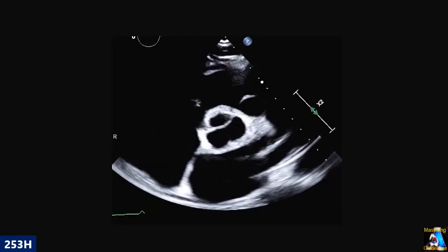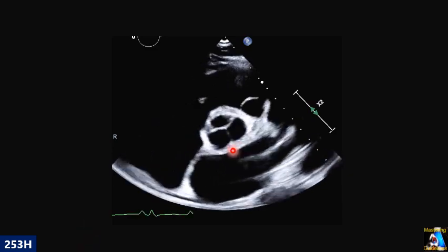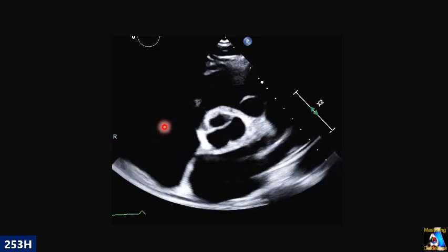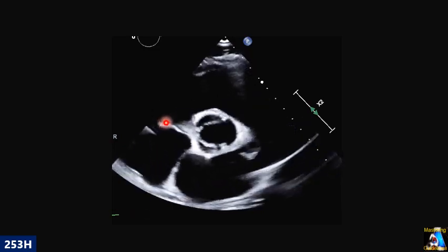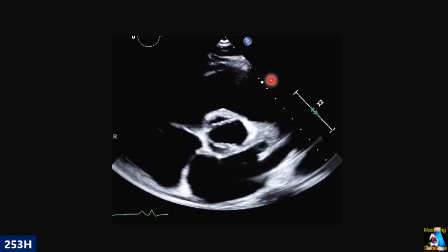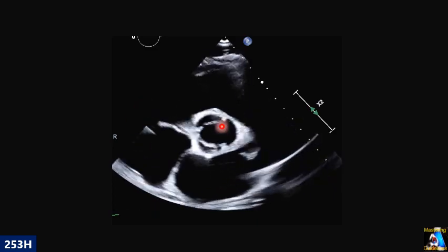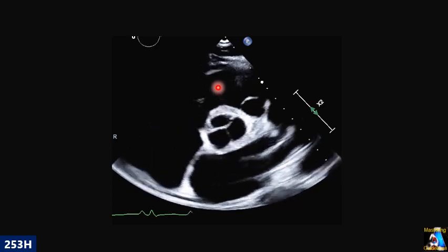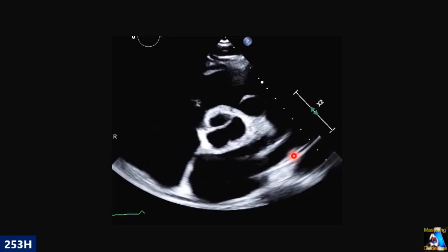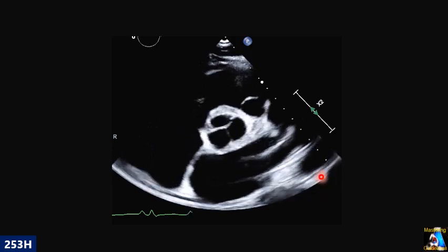Here you get a PSAX at the base of the heart at the valve level. You have the aorta very clear, nice, but you don't see all of the tricuspid. What maneuver should you do? Just one maneuver, to clear this area of the right atrium and tricuspid valve. Second, after you finish that one, what maneuver do you have to do? Open up to the pulmonary artery and show the bifurcation or saddle of the pulmonary artery.